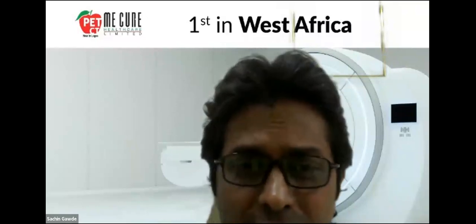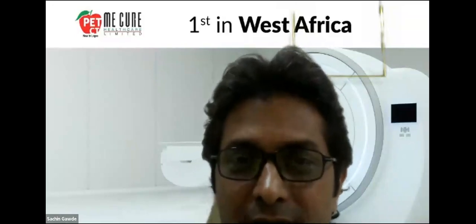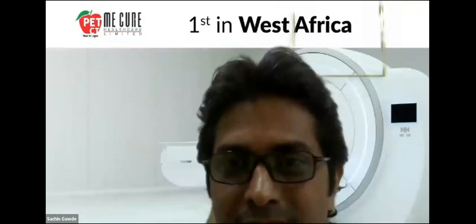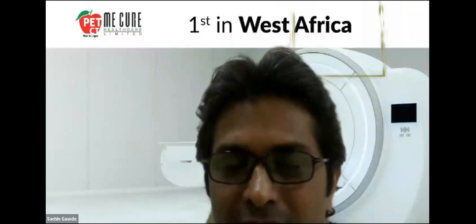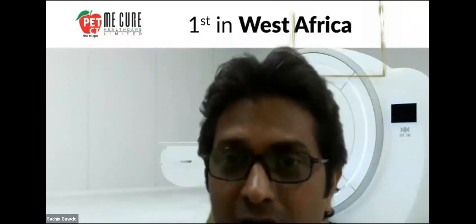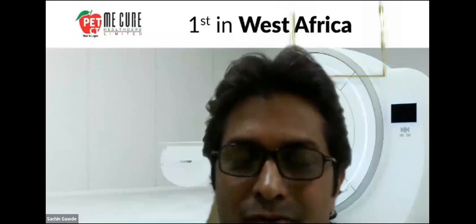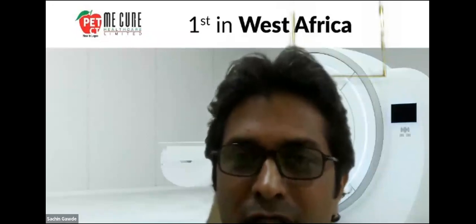And Dr. I forgot, just lost his name, the one who mentioned about the gallium generators. Yes, Dr. Garba. I'll just touch upon that gallium generators right now, they look very fascinating, and they are also rewarding, but they are only limited to prostate and neuroendocrine cancers.